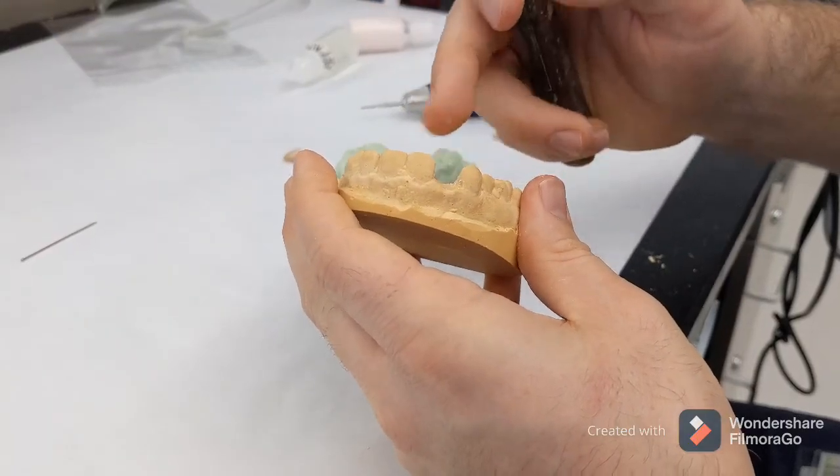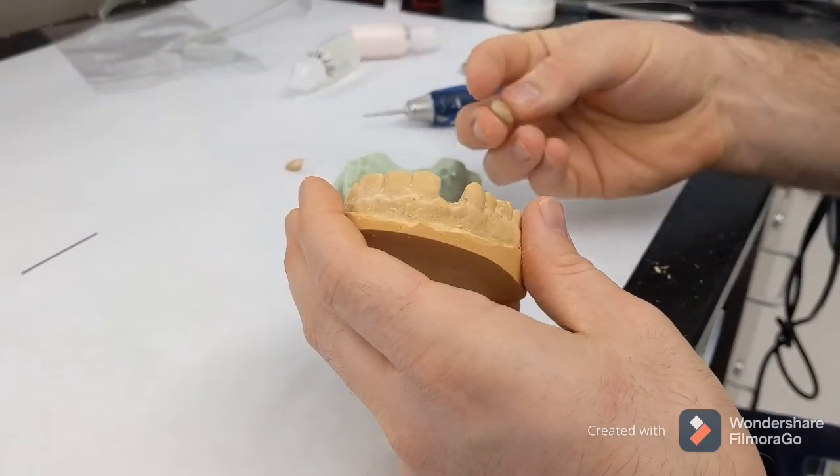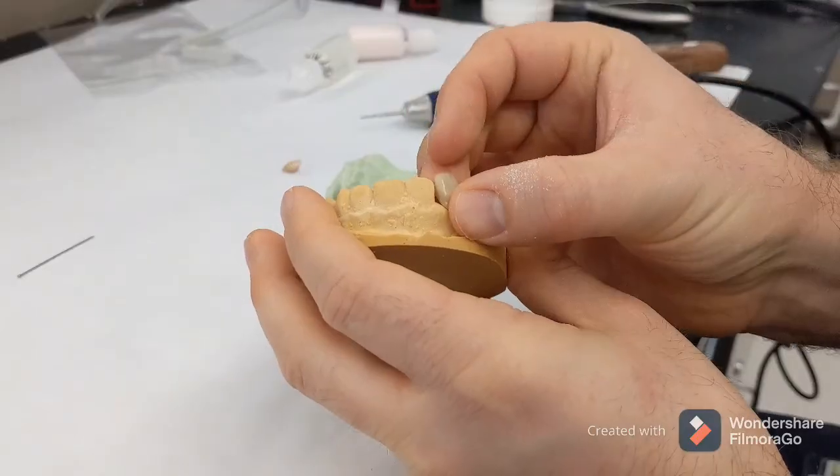Clean out the space as if you extracted the tooth. Now we've shaped our lateral, but it's too tall.